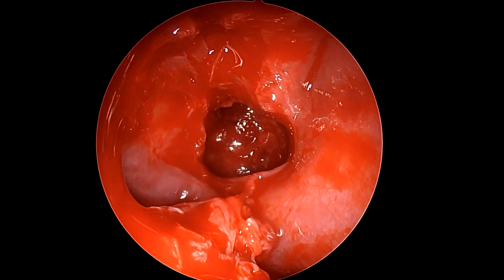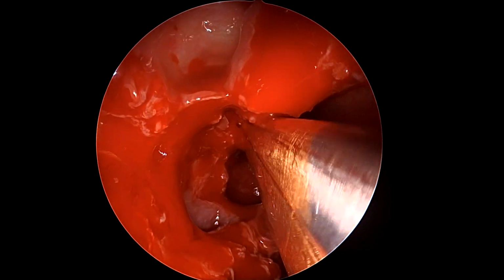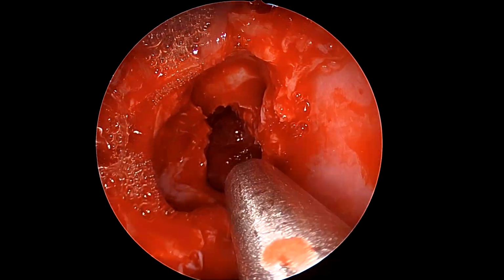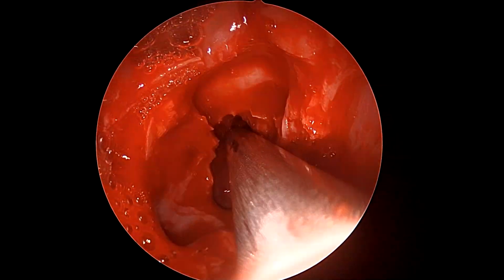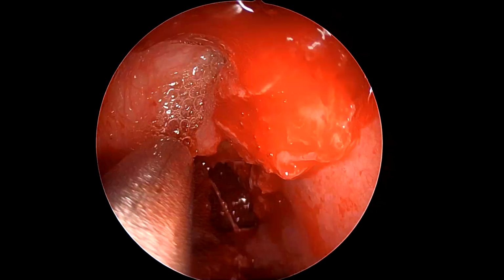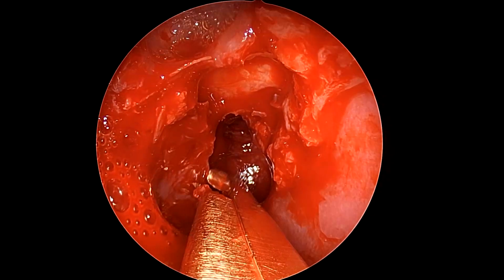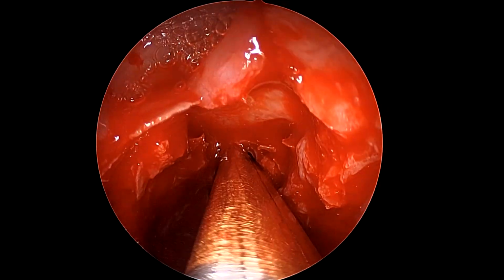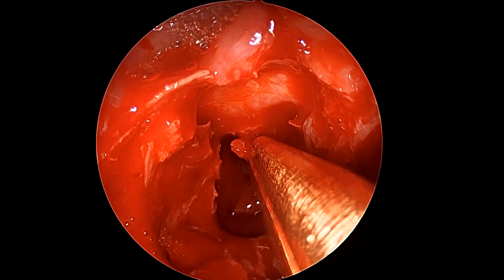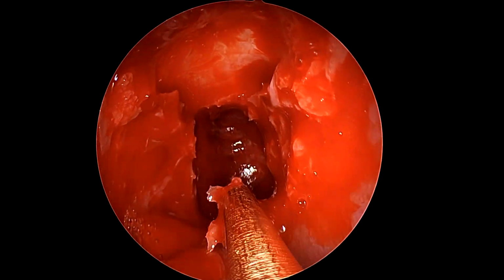The sphenoid has been completely opened now. You can see that there is a bulge inside the sphenoid sinus from the sellar mass. And now with that bulge in picture, we are using a Kerrison punch to progressively enlarge the sphenoid anterior face right to the planum sphenoidale, and we'll keep coming back towards the ethmoidal roof so that we have the entire foveal roof that moves towards the planum in one line of action and line of sight, both for visualization as well as for comfortable instrumentation.